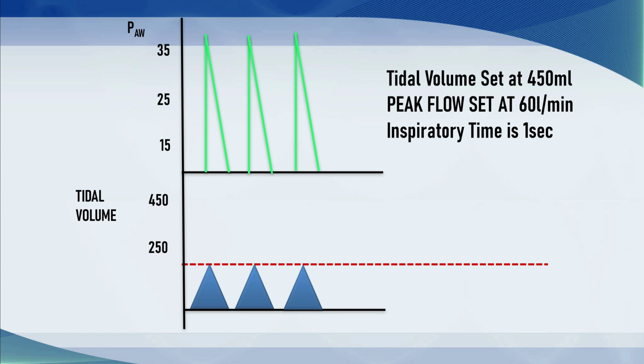The patient may have bronchospasm, they may have a lot of crud or mucus in their airways, may have chronic inflammatory changes, and that rate of flow is just too much. So the peak pressure that's seen by the ventilator in those airways bounces back on the ventilator, it just pops off and the patient hits that pressure limit that I mentioned earlier on. So it just pops off at far too early a stage before the tidal volume has been delivered. And so you end up with these really low tidal volumes and lots of alarms and a lot of discomfort for both the staff and the patient.